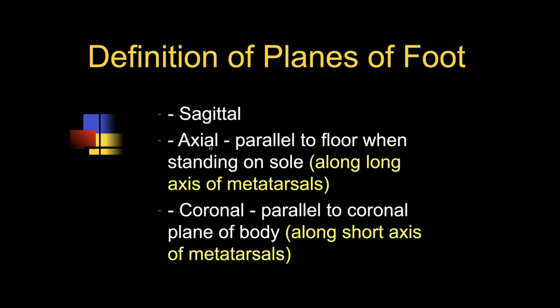I generally find that about half of radiology groups use this correctly and about half don't, but it can cause a lot of confusion. And we still have problems with labeling a lot of the studies in RadNet when we have technologists who are part-time or per diem, who spend most of their time imaging for other radiology groups, and they come in and image for us, and they incorrectly label the planes of the foot. But this can be a significant problem, and in your practices, you'll have to make sure how you're going to deal with this. Why has this been going on since MRI has been invented?